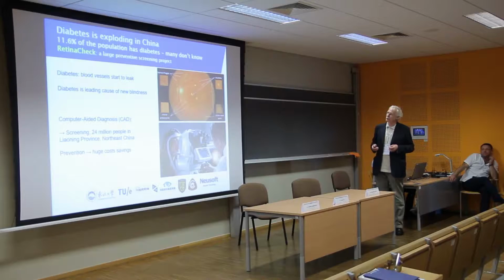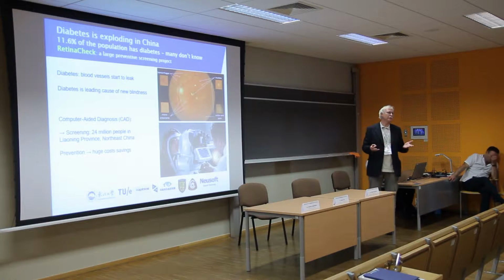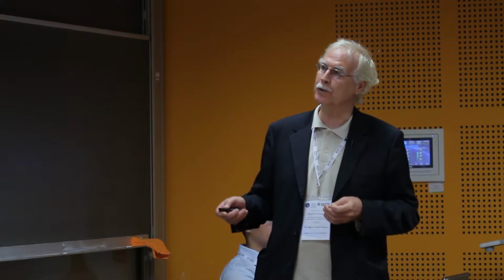That school was founded, and then a major hospital group of eye hospitals came to us and they said, well, we need your help. We are going to set up a screening program for the elder half of the population of this province. That's 48 million people. We're going to scan 24 million people, cameras like this, we make these kind of images, and we need computer software to do this automatically. By far, we don't have enough doctors to do that. And today, we have already hundreds of cameras now operational, and I'm going to talk to you about this project.